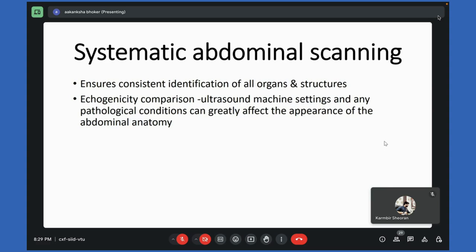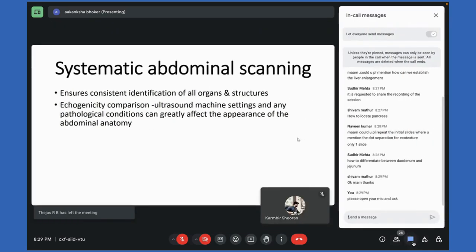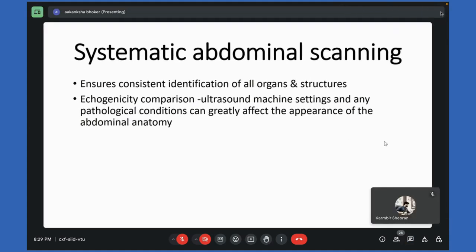And in every sonographic examination, if you are interested in the bladder, are you scanning only the bladder, or are you following a protocol wherein you scan the entire abdomen? So make it a habit. Try to locate each and every organ every time. Maybe you will have to spend some time. Don't hurry, don't rush to scan it in 5 minutes. Give it some time. Then it will become second nature.